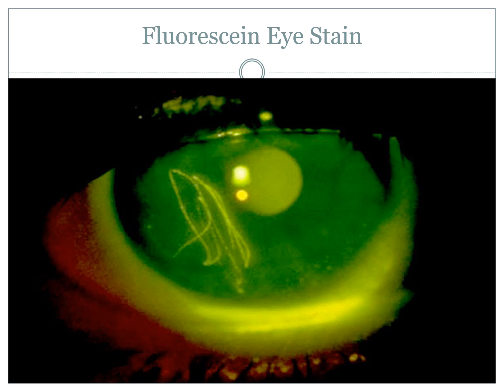Today's pearl we're going to be looking at the Fluorescein eye stain. Now, Fluorescein itself is extensively used as a diagnostic tool, especially in the field of ophthalmology. It is a yellowish green fluorescent compound. The compound can be used to demarcate the vascular areas under observation, especially observation with cobalt blue light, and this aids in distinguishing it from the adjacent areas that aren't demarcated or aren't broken.